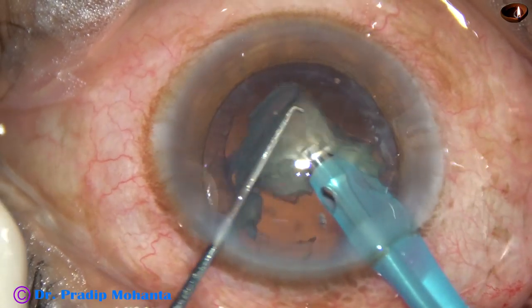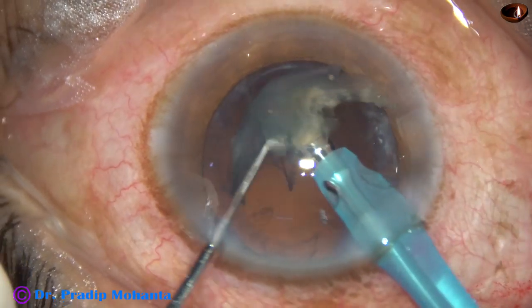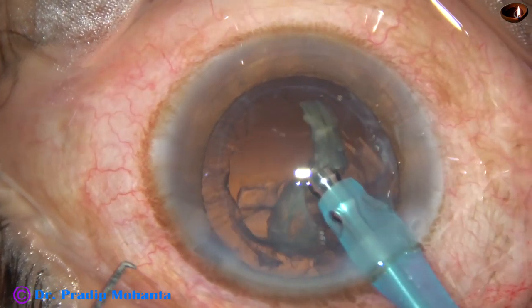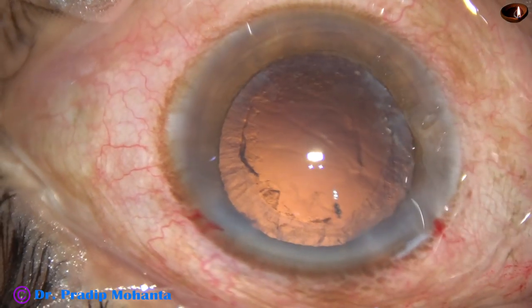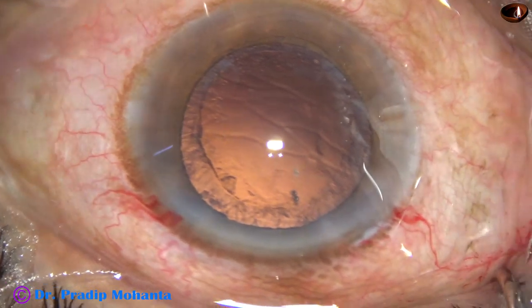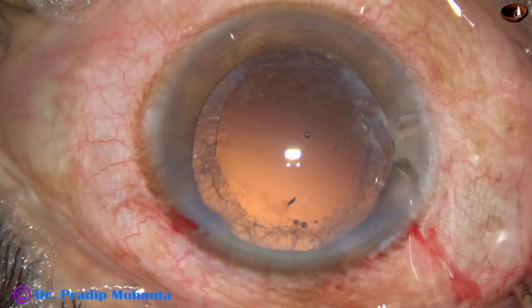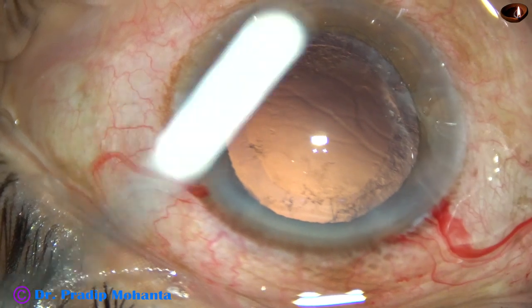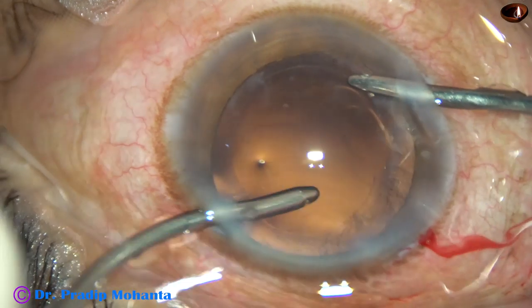We have to be very careful while emulsifying the last fragment. The chopper is removed so that there is no leakage of fluid from the side port and the chamber remains very stable. We can also use an instrument called a posterior capsular protector, or come back to phaco-on mode where the vacuum is only 50 mmHg for emulsification of the last piece.